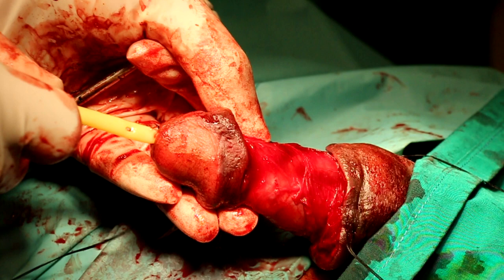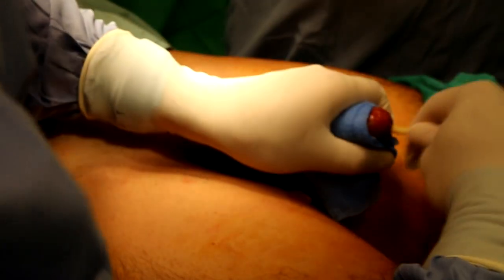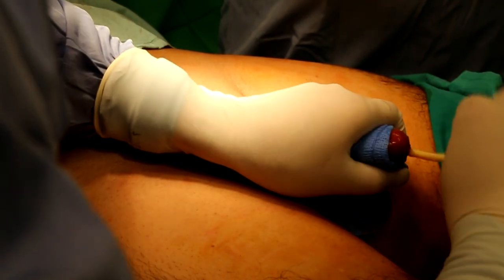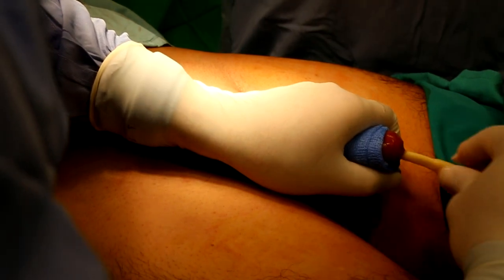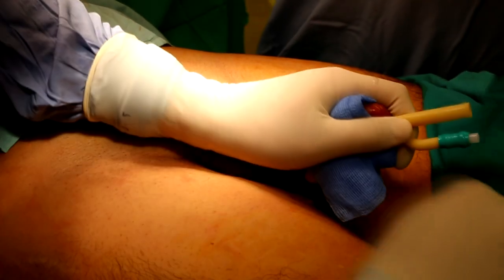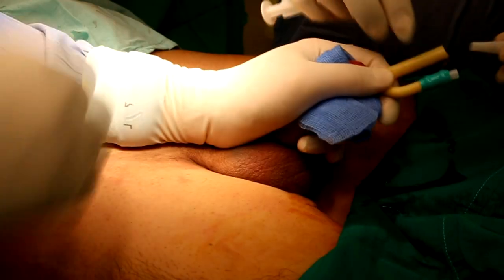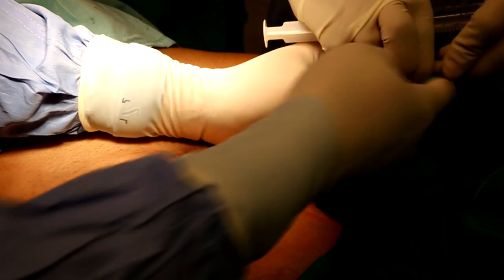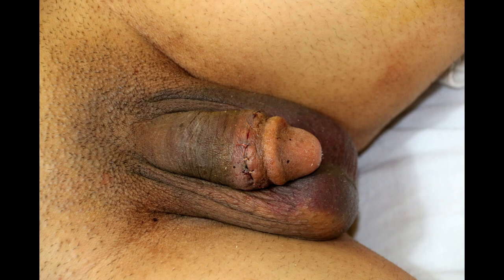Otherwise, if there is no urethral tear, I prefer to put a urethral catheter just for 24 hours. Voiding will be painful for the patient without a catheter, so 24 hours will be quite enough. This is for sure a good indicator of an intact urethra. Here's a picture 24 hours after.